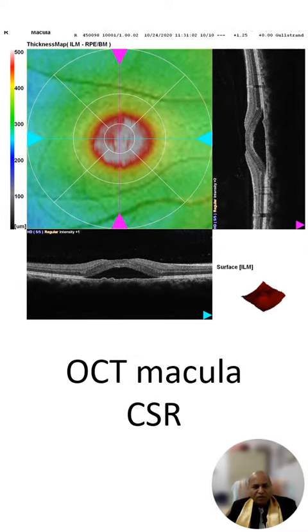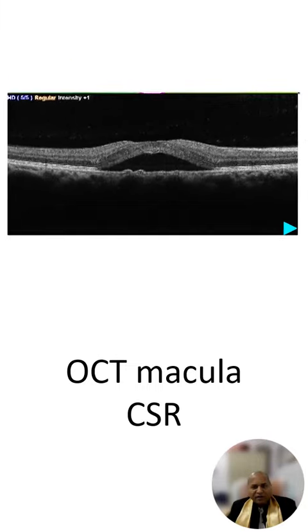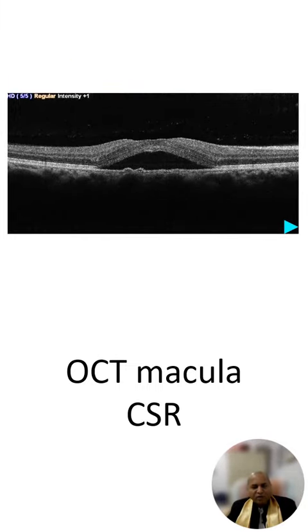When we look closer, we find that there is a cystic clear space between the retinal pigment epithelium and the neurosensory retina, centered at the foveal area. On further magnification, we can also appreciate the changes in the retinal pigment epithelium.